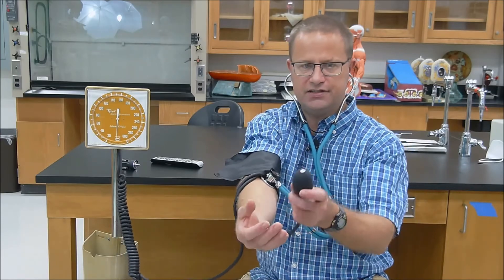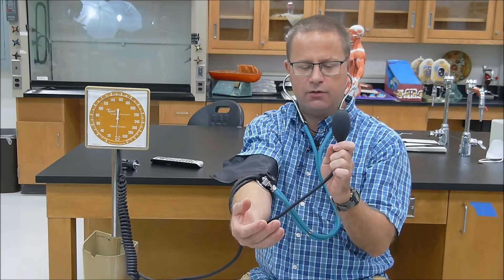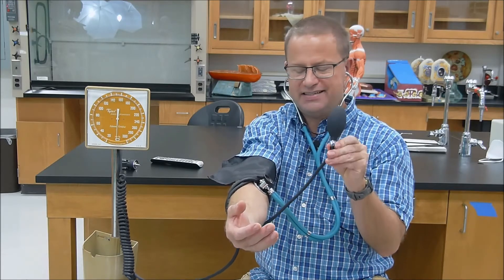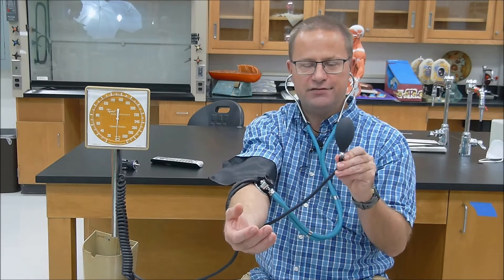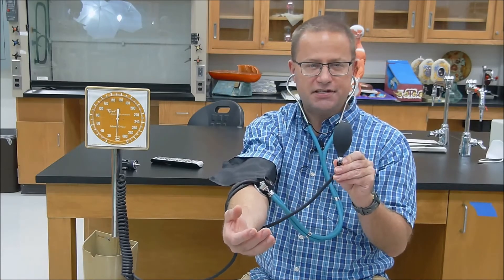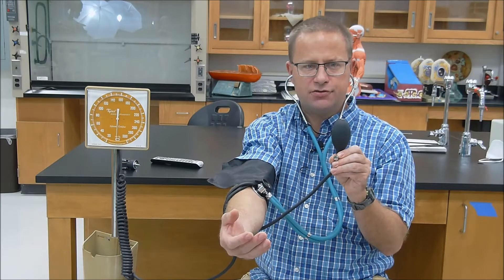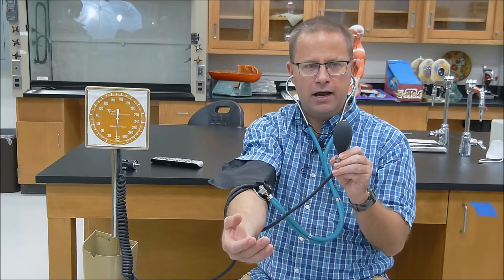Next you want to get your pressure cuff, and you want to turn that little knurled knob all the way clockwise. That's going to close things off so that all the air that you put inside that cuff stays in the cuff and doesn't come out. We're going to fill this up to around 160 millimeters of mercury, and then we're going to let off gradually by turning this a little bit counterclockwise. As that pressure drops down on the sphygmomanometer, I should start to hear heartbeats at some point.